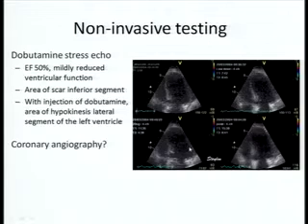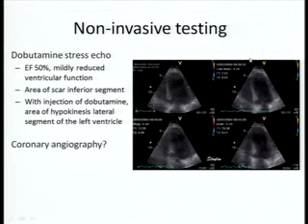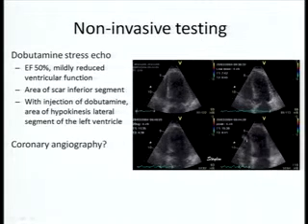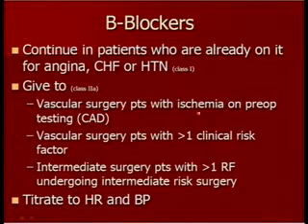Several of these patients who go for surgery may have minor electrocardiographic abnormalities, and they may not be fit enough to undergo a formal exercise stress testing. And this is where a dobutamine or a pharmacological stress test comes in: you give dobutamine and look at the wall motion abnormality at peak dobutamine stress. And if it becomes abnormal, you feel that this patient has a provocable ischemia and he would require further evaluation.